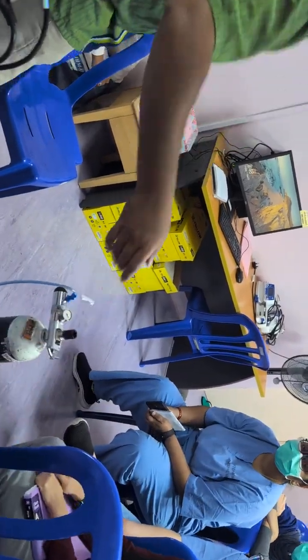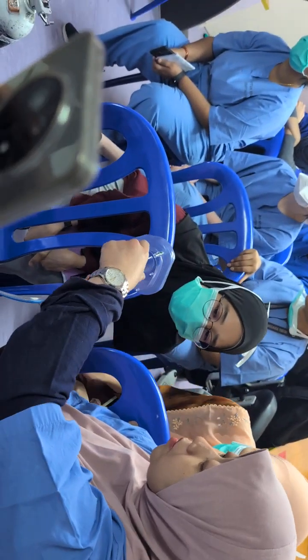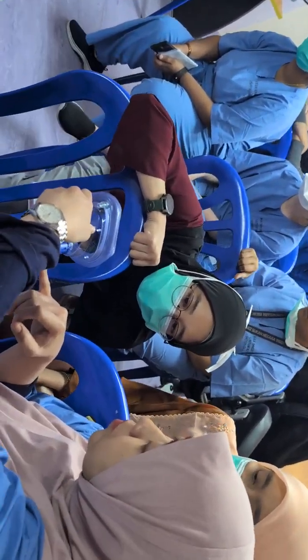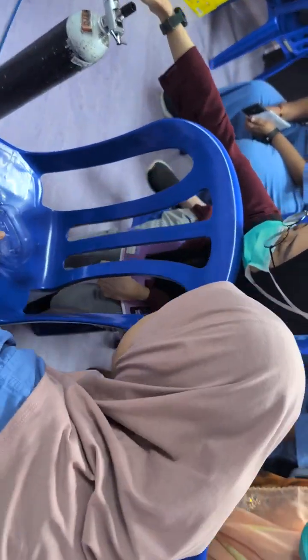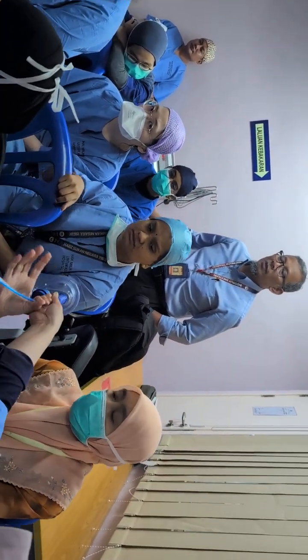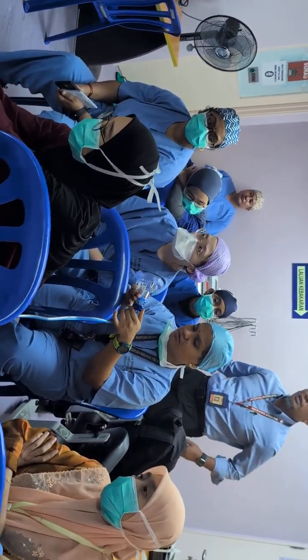What's the flow of the oxygen? 6 liters. 60. But we are not giving 60, doctor, in this case. The reason is because for 60, we require the dual flow meter. So here, we are not giving at 60. For sure, we are giving lesser than that. It seems like the high flow is similar, no? Yes, we are using a high flow oxygen plus the air. So constantly it will drain the oxygen from the cylinder.